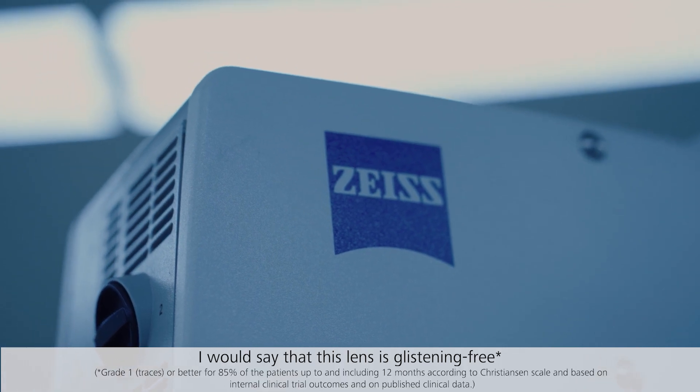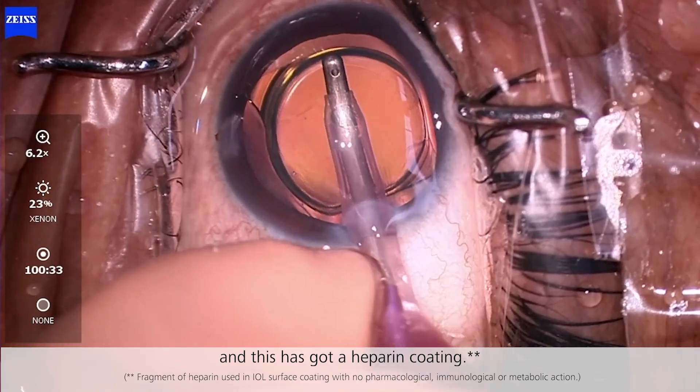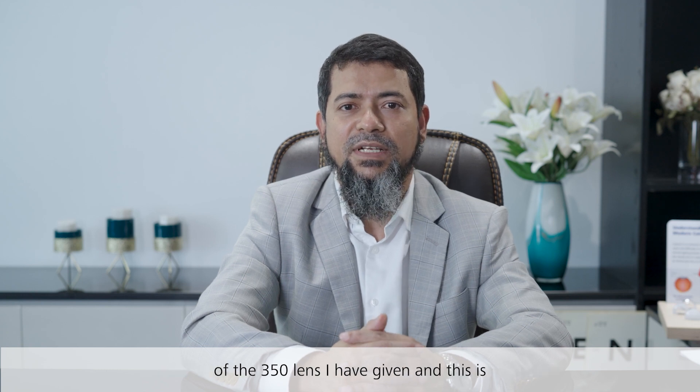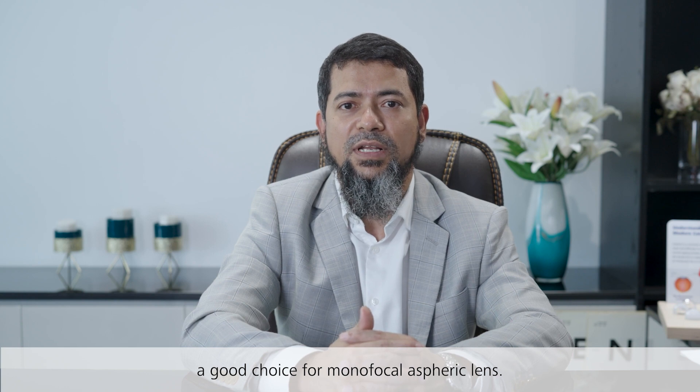Two other important things: this lens is glistening-free and it has a heparin coating. I am very impressed with the performance across the 350 lenses I have implanted, and this is a good choice for a monofocal aspheric lens.